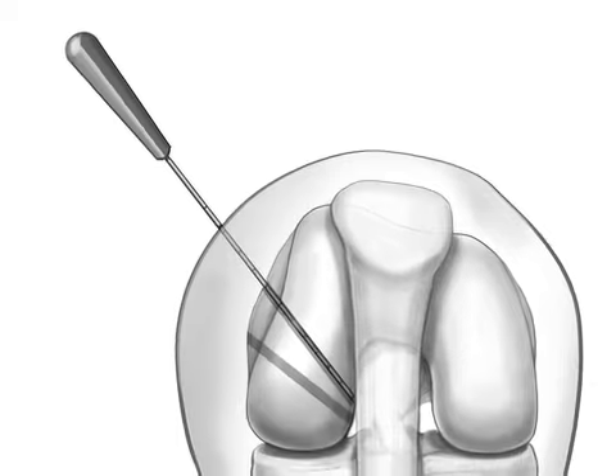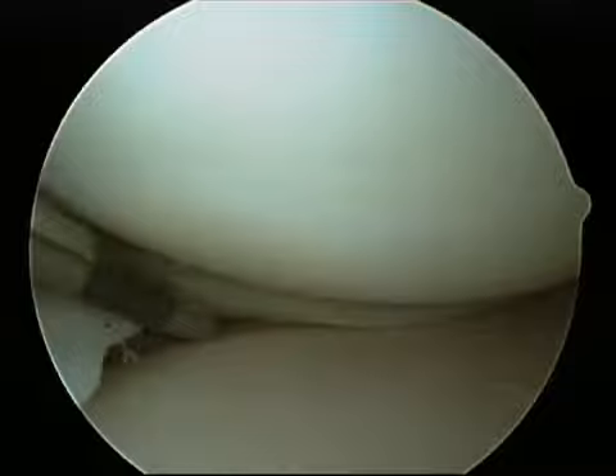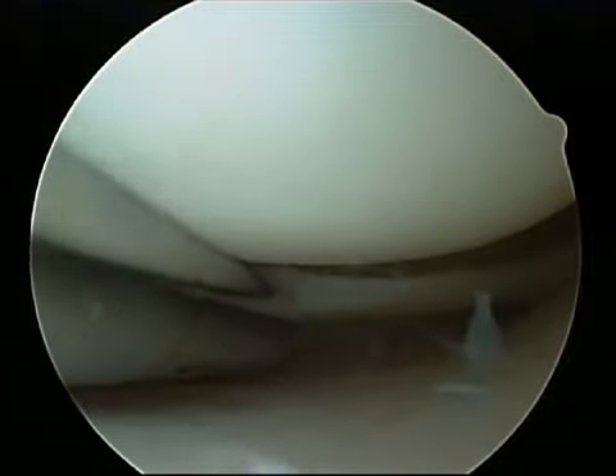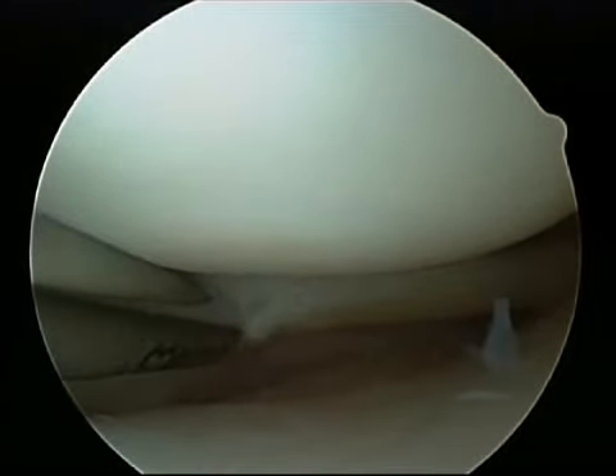Instruments can be inserted into the knee through very small incisions. Here, a probe is utilized to determine if there are loose flaps of cartilage, or if there is an unstable meniscus tear. Here, a shaver is introduced to help clean out the knee of any debris.